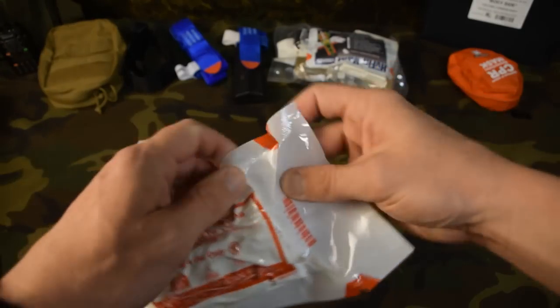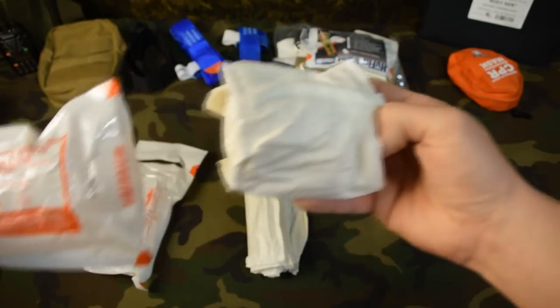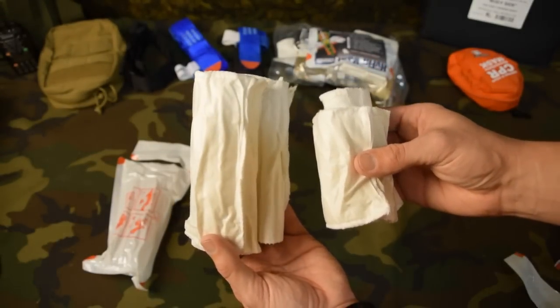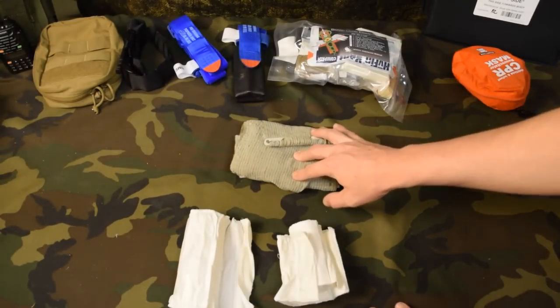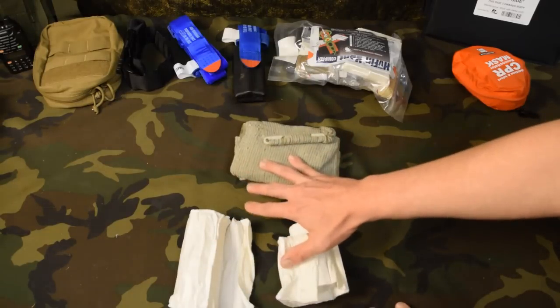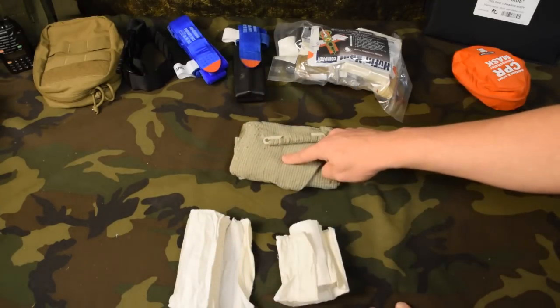Same thing with the four inch version — pops right out. Once we get them open, you can see the size comparison. Obviously one is the six inch and the other is the four inch version. Up here is your Israeli bandage — this is the one you're probably most familiar with. There are some similarities between these products and then there are differences, and I'm going to show you both.